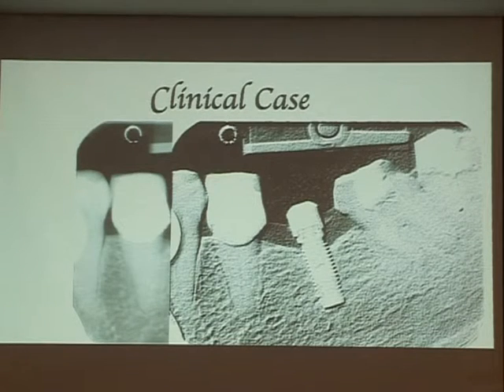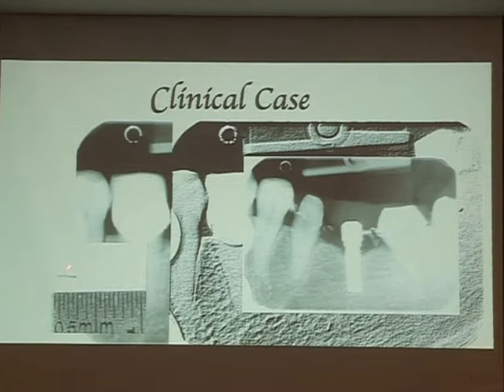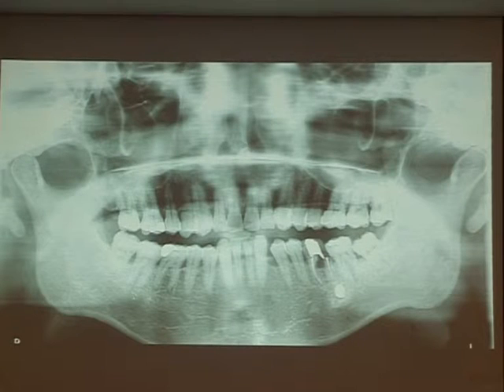So in the second visit, I saw there's a fractured file. Some of the software has a 3D mode. So you can see there's a piece of instrument standing out from the GP. So it's a fractured instrument. So I spent more time to remove it. I cannot charge for it because I didn't give any quotation for the separation. I misdiagnosed. Okay, it's my fault.